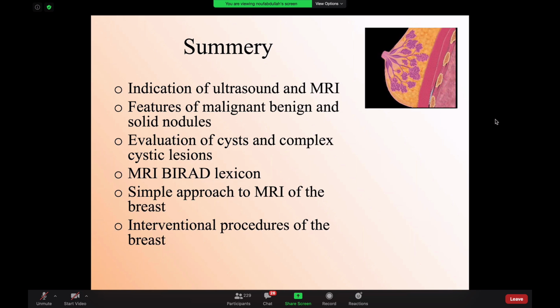Okay. Dr. Arim is asking, can you please repeat the specimen radiograph part, and what do we need to know for the exam? So a specimen radiograph is an X-ray of the surgical specimen. The patient went for surgery, they resected part of the breast, for example an area of microcalcification, and then you do an X-ray of that surgical specimen. You want to see: is the clip there? Is the microcalcification there? Is there a good margin around the area of the suspicious lesion?